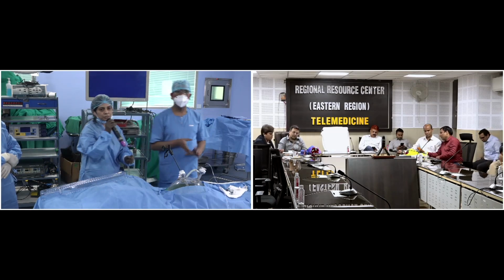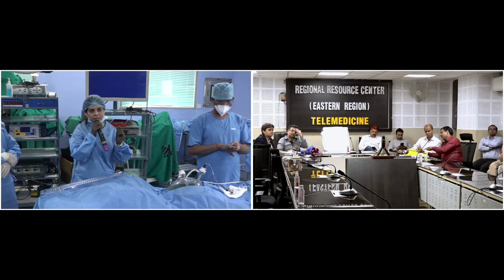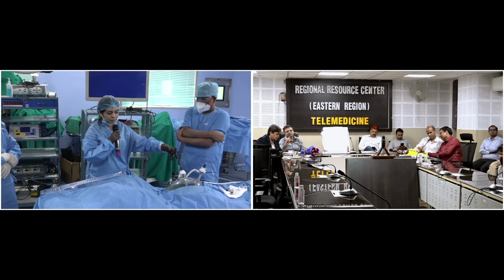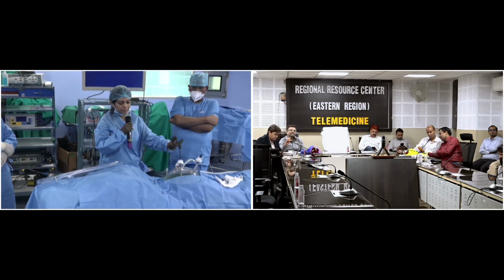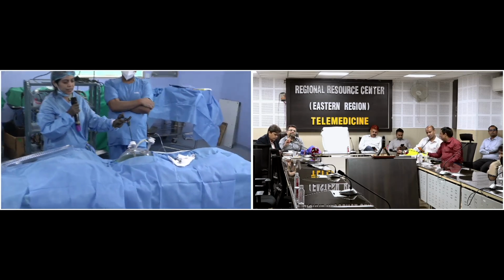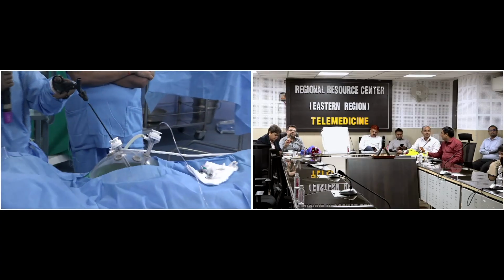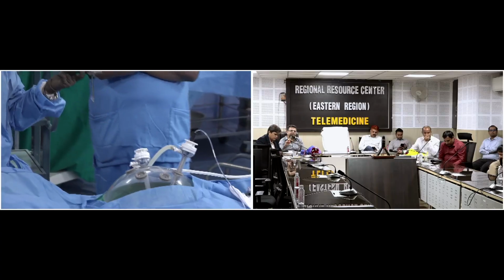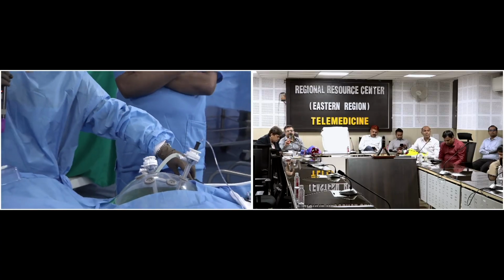That is why, Tarun, it's not only biopsy, you also need MRI, to be sure where you are heading. And as you can see, this is a simple grasper that we regularly use. You can take biopsies from any quadrant. That should not be a problem. You don't need to dissect and take a very deep biopsy. Okay, thank you.